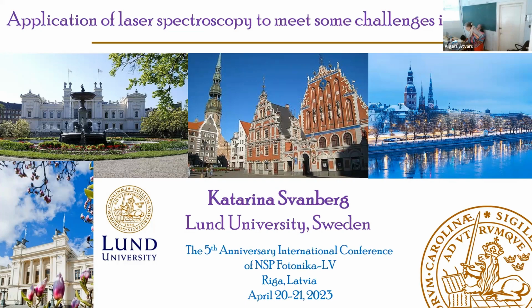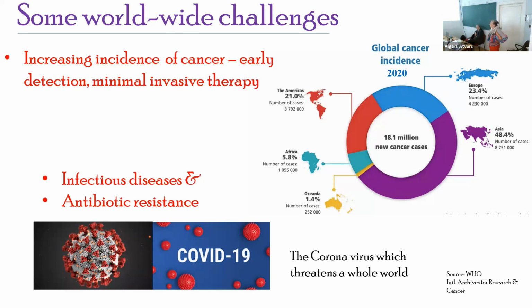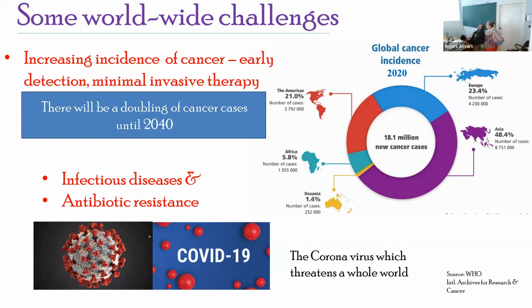We have some world challenges which we have to meet, and one of them is the increasing incidence of cancer. We know that there will be a doubling of cancer cases during this time span. And of course, early detection is a key for the prognosis of the patients. We have been working a lot with the detection of early cancer, and have been using laser-induced fluorescence a lot for that purpose.